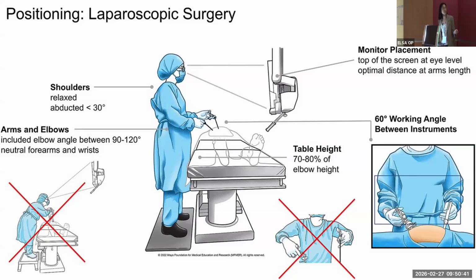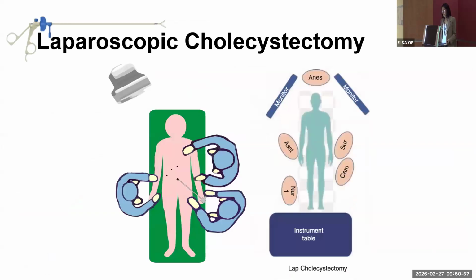And as you see, the instruments are a little lower than the waistline as well. Also make sure that the stepping, like the diathermy pedals, the step boards, they usually put it here also, so we don't twist our ankles when we're operating.